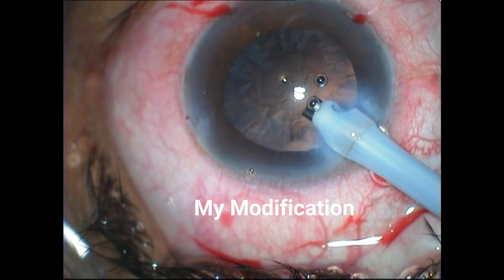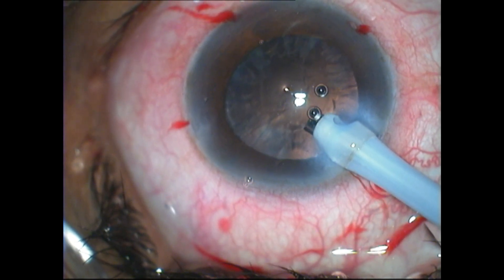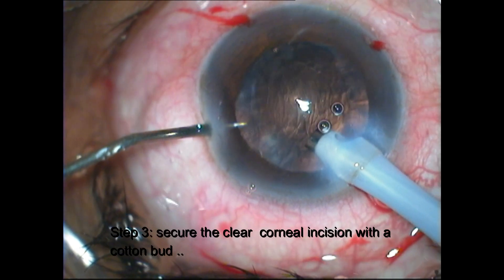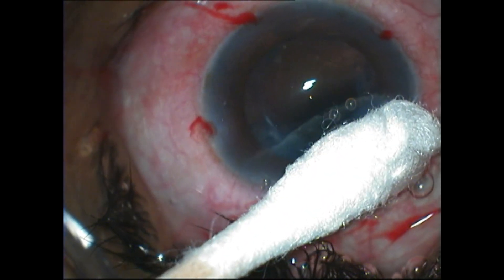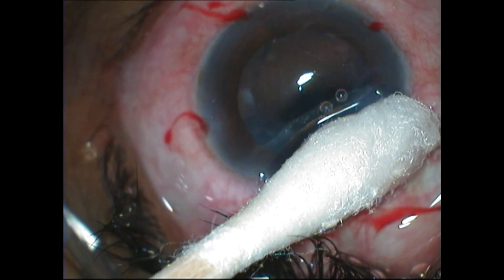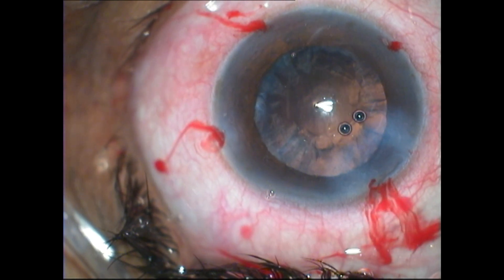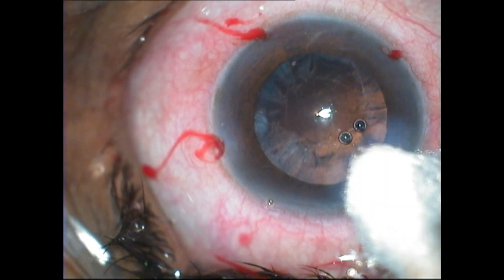I therefore suggest a modification to the technique of visco fluid exchange. The first and second steps are identical — turn off irrigation and fill the anterior chamber with viscoelastic. The modification lies in step three: secure the clear corneal incision with a cotton bud before pulling out the probe. Press the clear corneal lip with the cotton bud for a count of about 20 seconds. This will seal the clear corneal lip and ensure there is no extrusion of intraocular contents. This is the best way to perform visco fluid exchange.